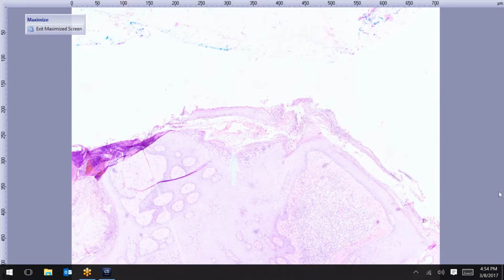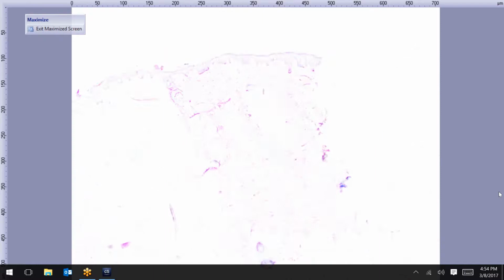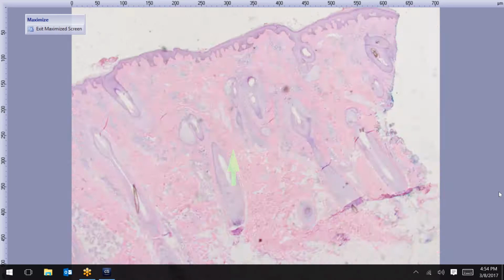And then, looks like we've just got a few more minutes here. This is a big piece of tissue. It might be a little challenging on this system to show you, but let's get through it because this brings up a whole big differential. So we got this large tissue. I'm just going to tell you it's from someone's scalp, which you almost can sense.